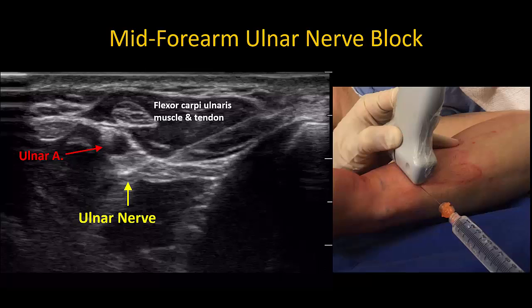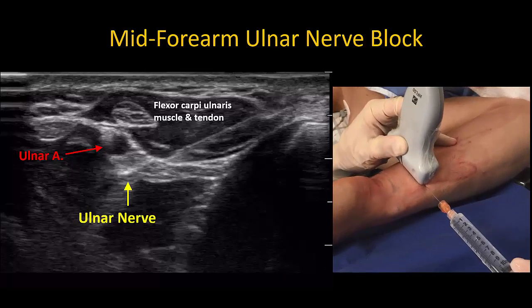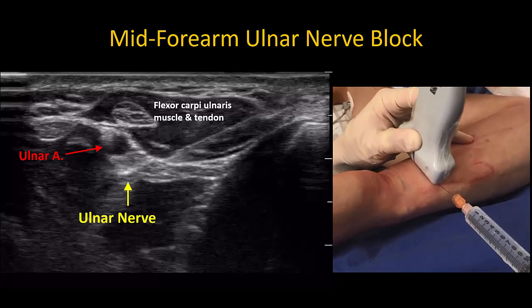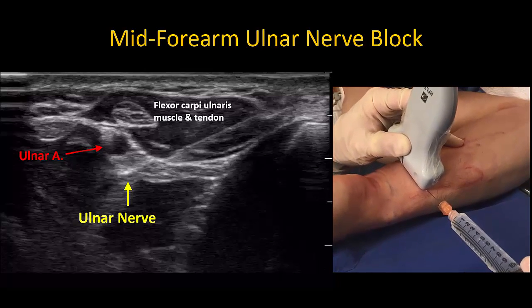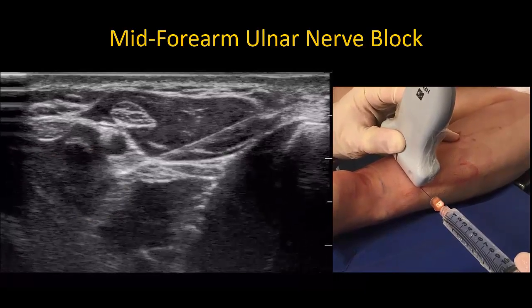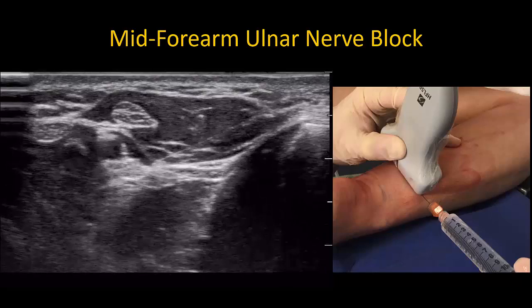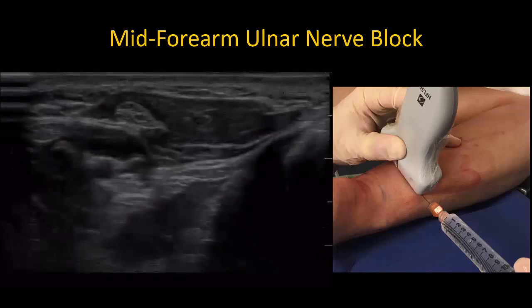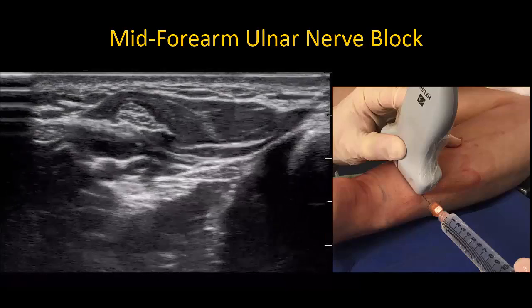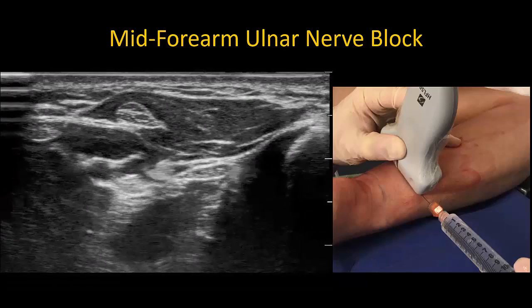In this video, the ulnar nerve is targeted at a more distal location where it is lying adjacent to the artery. More experienced practitioners can use a single-operator technique with a 25-gauge hypodermic needle. Once the needle tip is within the fascial envelope surrounding the nerve, further needle tip manipulation is generally unnecessary.